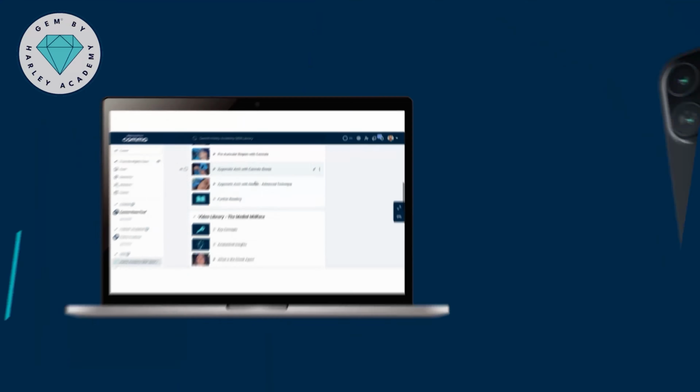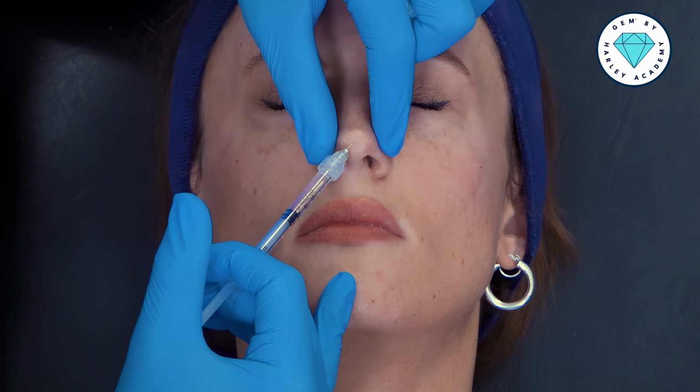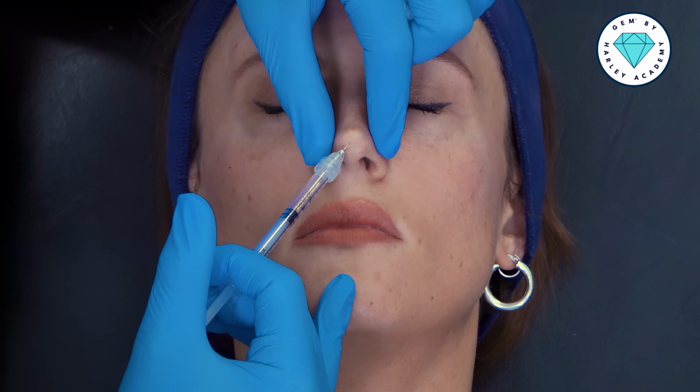And we're going to start off with some lidocaine to try and make things a bit comfortable, but the initial sting can be a little uncomfortable. So here it comes. Well done. Okay, a little bit of stinging. Bear with me. Well done. That's it. That's the worst part. The worst part of the treatment done.